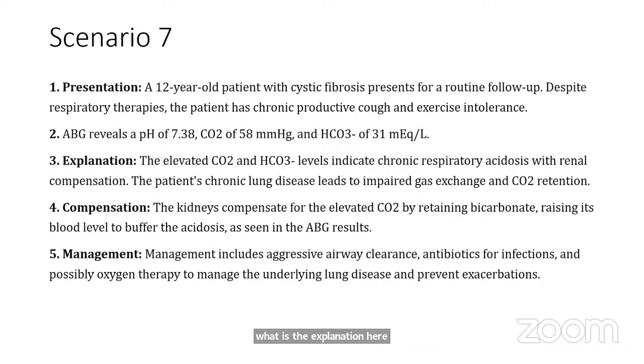So there is elevated CO2 and elevated bicarb. This is a chronic respiratory acidosis. Is there a compensation? Yes, there is some compensation. Again, I told you that usually at the bedside, at least what I do as a clinician, I look into the compensation. Yes, there has been a compensation, but usually I do not look into whether there has been an appropriate compensation. This is cumbersome, and two is that I think it adds very little to our clinical judgment. But yes, here at least it's important to realize that there is some compensation.